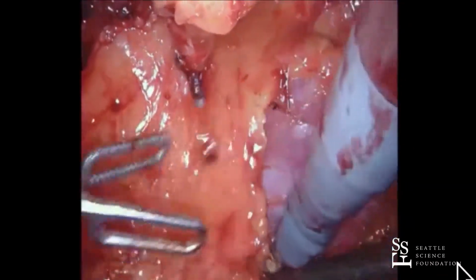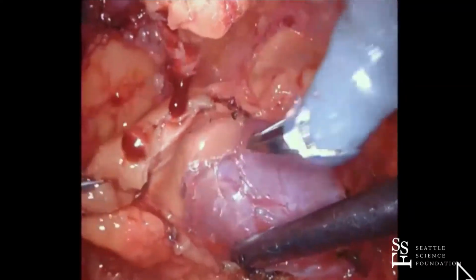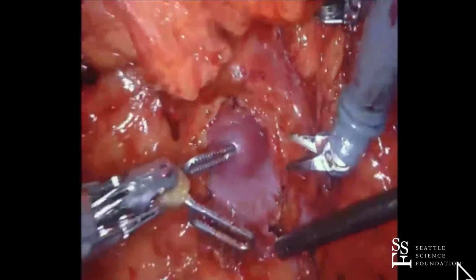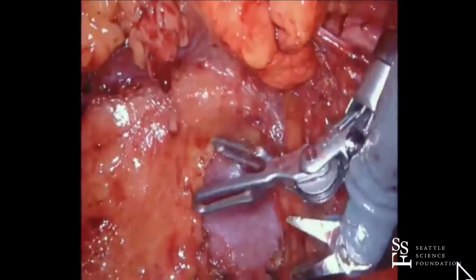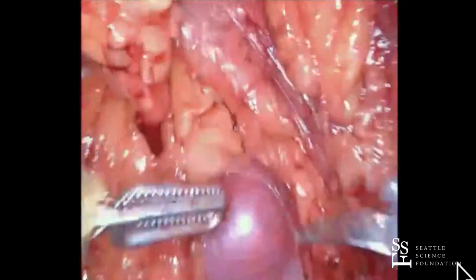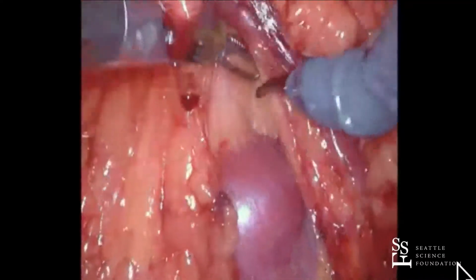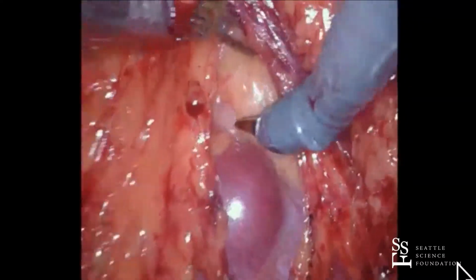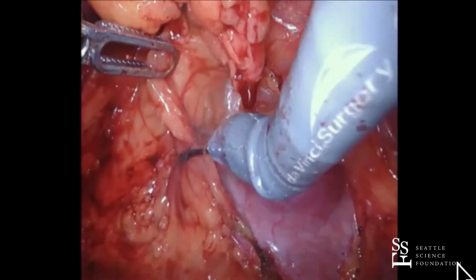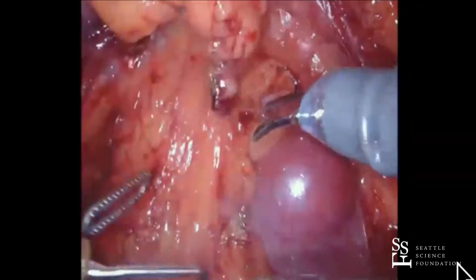So this fat is not sticking to the tumor, so you could argue, what are you going to do about this fat? Should we take it off separately? Should we leave it on? In my experience, if this fat comes off like that, that's not T3 disease, so I don't worry about it. Yeah, that looks like an oncocytoma anyway. It does. I don't think so. I'm messing with you. I think this is renal cell carcinoma, from what I can tell. The one advantage, Ronnie, to the Aloka, although I use BK, is that because you're holding the fin from the back, you don't have that same clearance issue. Yeah, so you can kind of half be in and still use it much better than the BK. But I agree on the contact.